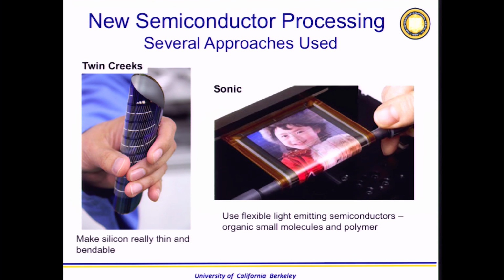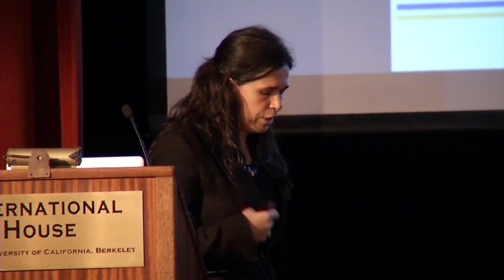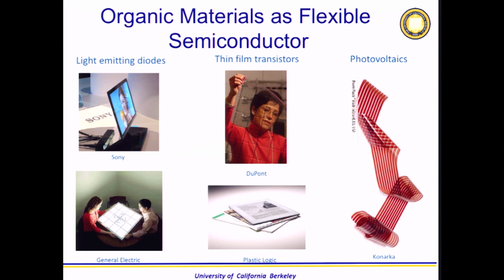Basically, these materials, as we know them in our day-to-day life, we know them as flexible materials, but now they have new properties. They can emit light, they can absorb light, and they can also carry current. They are good semiconductors, different from silicon. So when you start looking at organic materials that are inherently flexible, there have been several applications that people looked at, and you see that these materials can be processed at a large area.